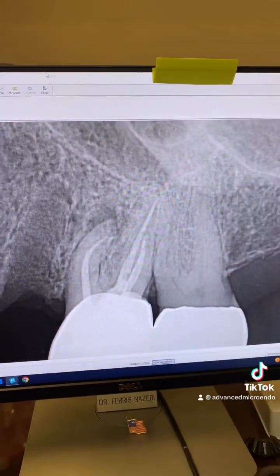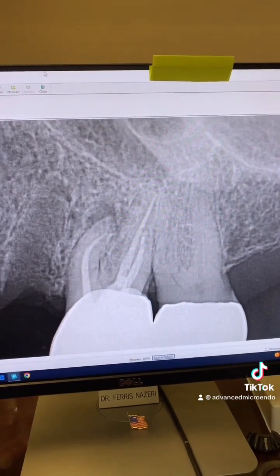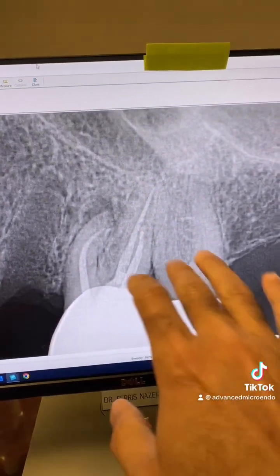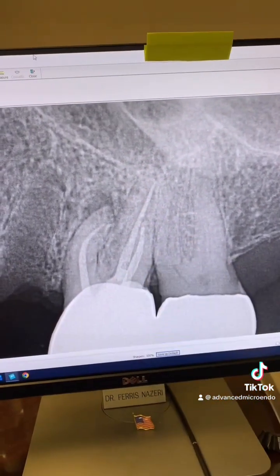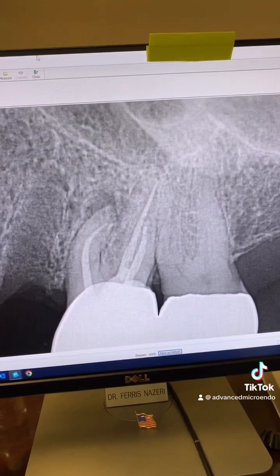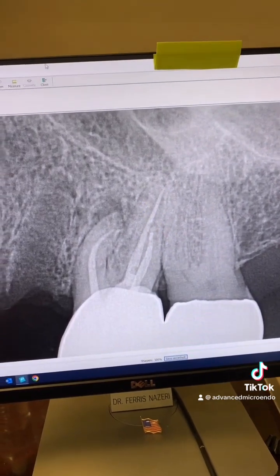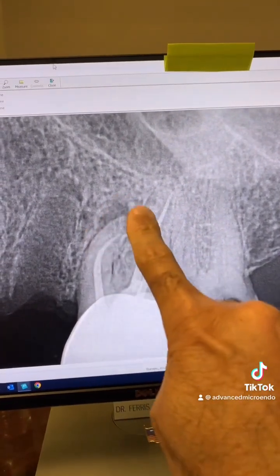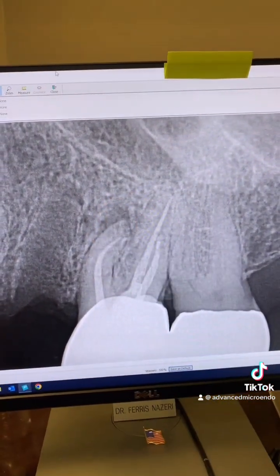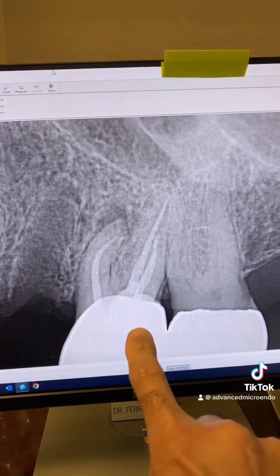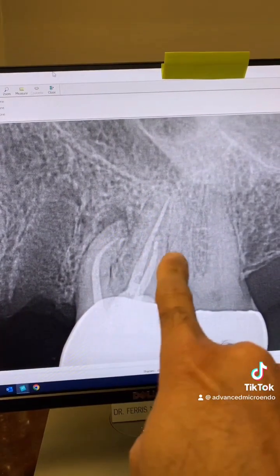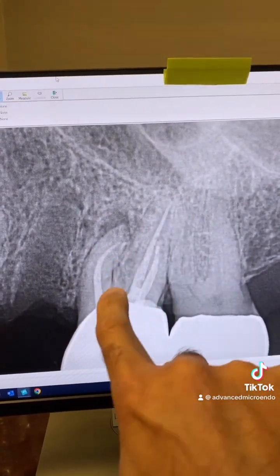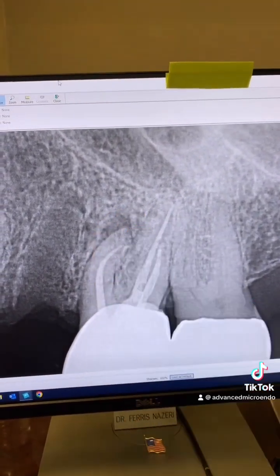This patient was referred to me for endodontic retreatment of tooth number 14. According to the patient, this root canal was done five to six years ago. You can see periapical lucency right there — crowned, with a previous root canal of course. Periapical lucency.